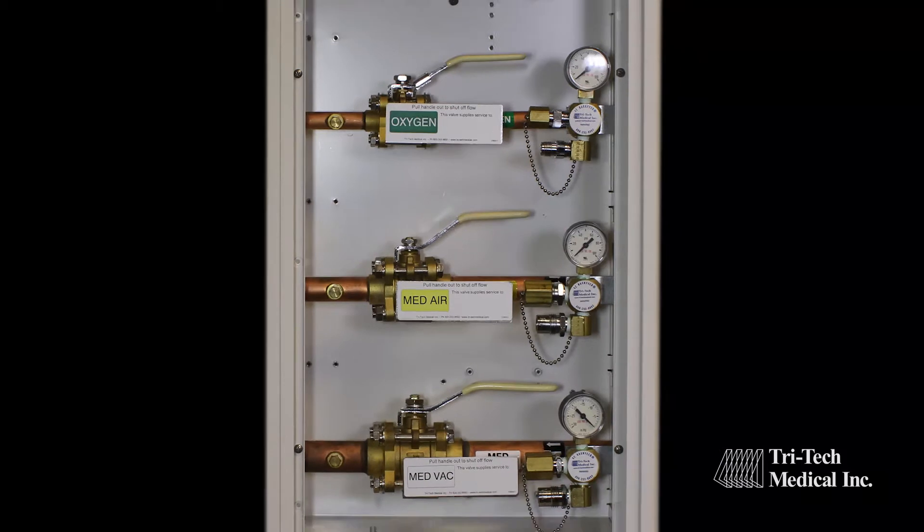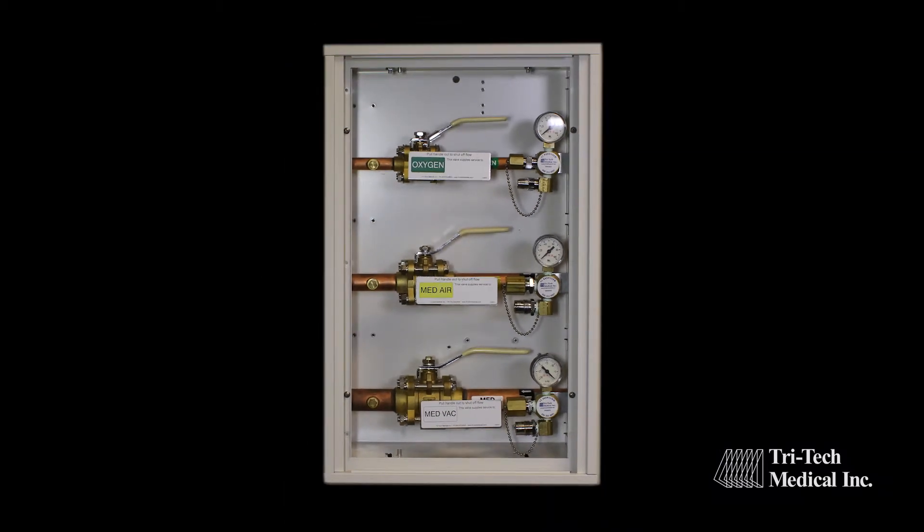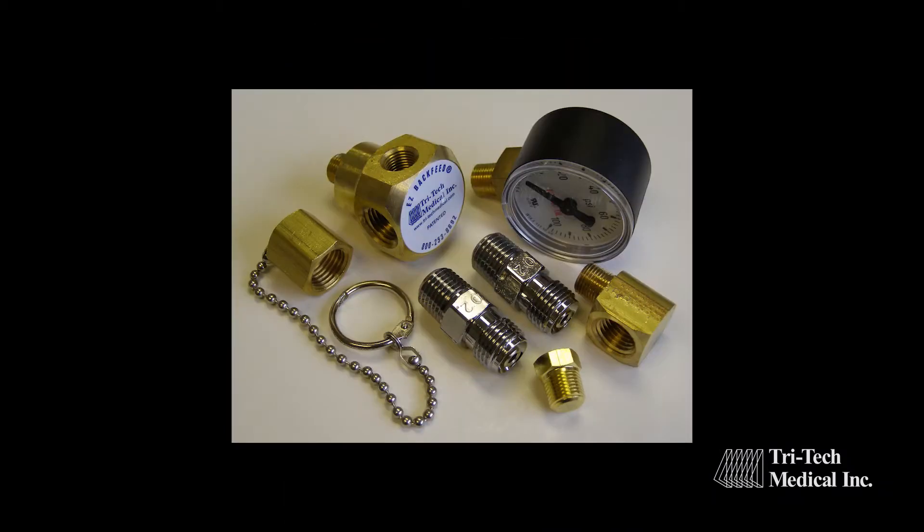You can purchase Tritec Medical zone valve boxes with the Easy Backfeed already installed, or you can purchase our retrofit kit to install the Easy Backfeed kit in most existing zone valve boxes.